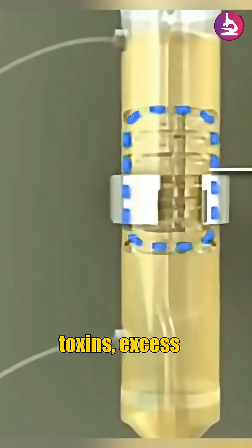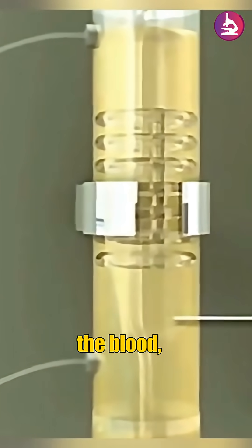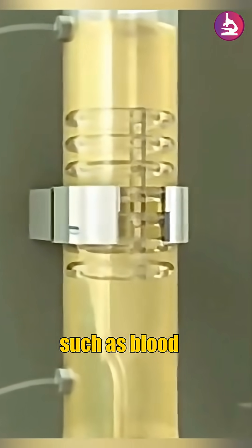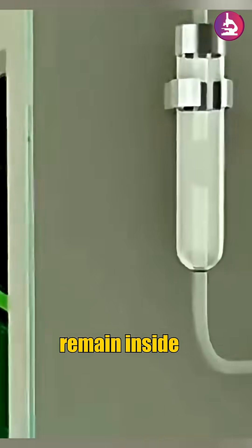This membrane enables toxins, excess salts, and surplus fluids to move out of the blood, while vital components such as blood cells and proteins remain inside the circulation.